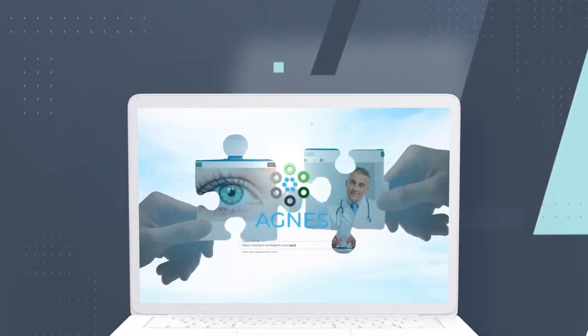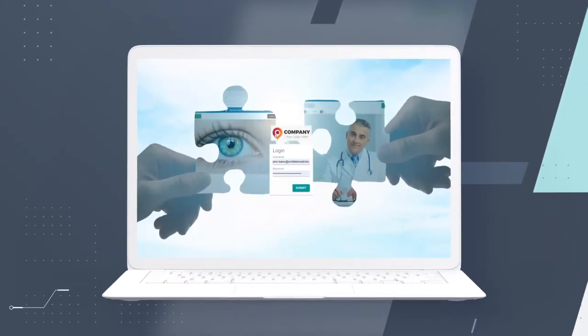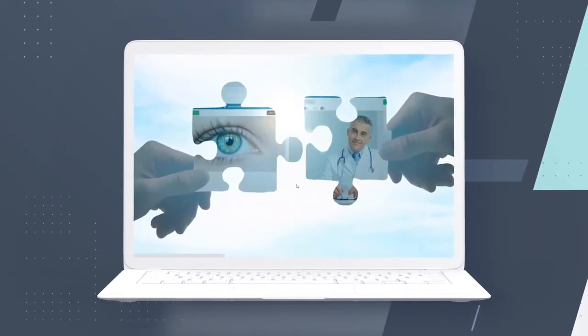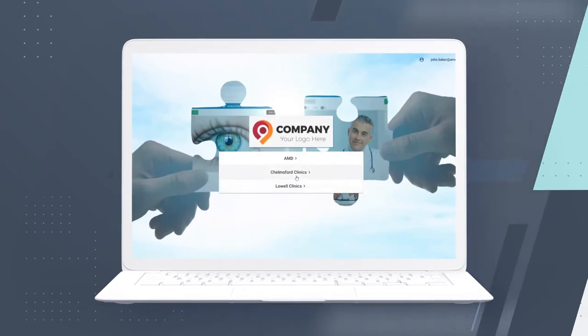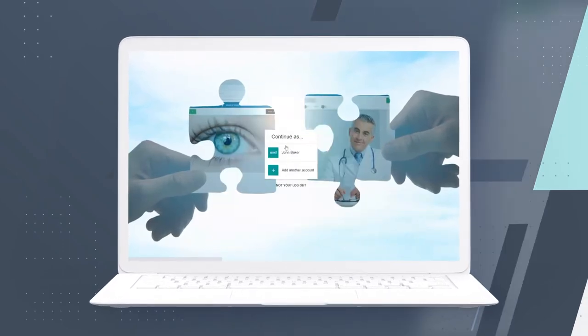Once the provider is ready to see the patient, they log into the secure HIPAA-compliant platform through a browser and then select the site or location they wish to connect to for the virtual visit.